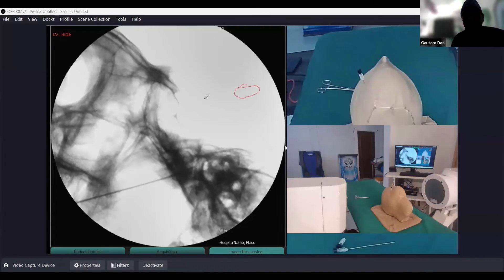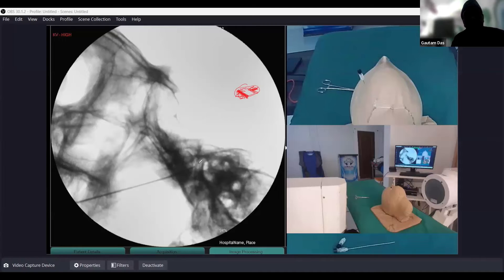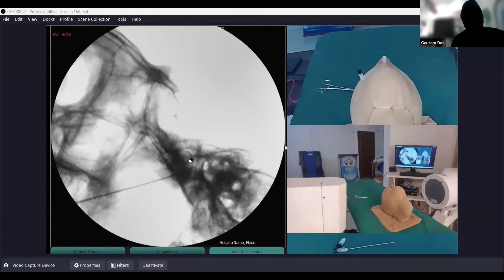In the oblique view, if your target is V3 (mandibular), this posterior-lateral part is your target. If your target is ophthalmic, then the superior-medial part. And if your target is maxillary, the middle part. In the lateral view, the needle tip position for maxillary is mid-range; a little more posterior for mandibular, and a little anterior for ophthalmic. This margin is only 1-2 mm, so the final needle position must always be confirmed by stimulation — check that paresthesia corresponds to the desired division.